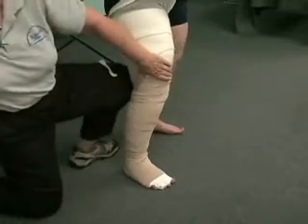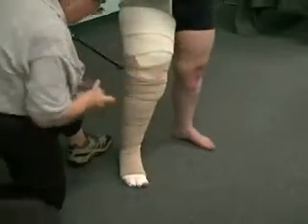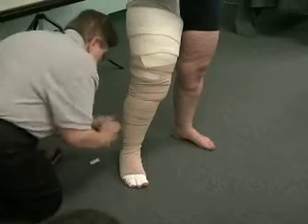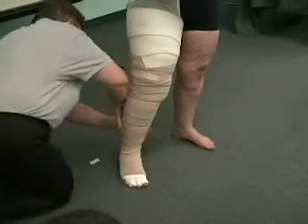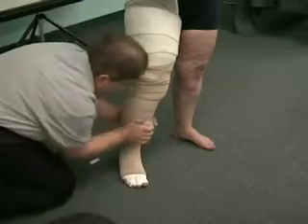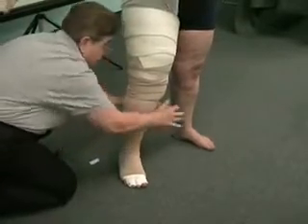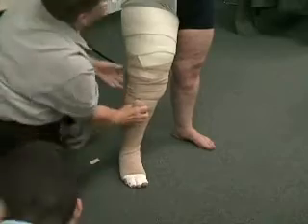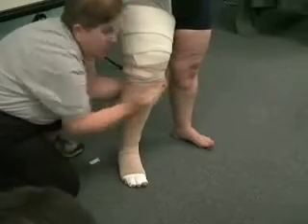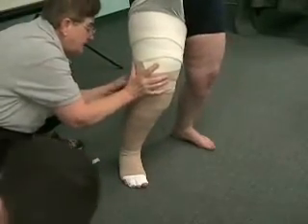Turn to me sideways. There you go. Soft. This one's hard work. Okay. Now, in these, you really look at the tension on the bandage. This is not an arm. This is a leg. You see how I'm molding it? Look at how firm this is becoming. Is that too tight? No. Honestly, it feels really good. Now, right here, because she has this bulge, bend your knee a little, that's enough, a little more. Okay, there you go. Perfect.